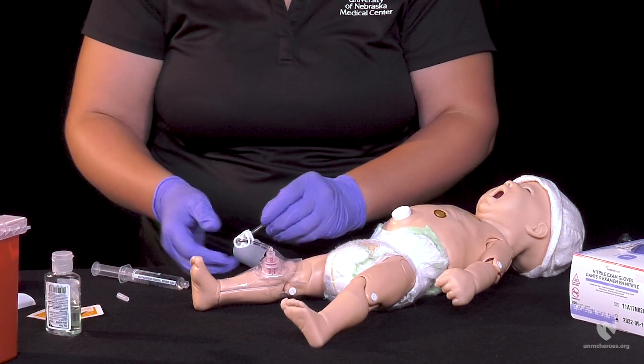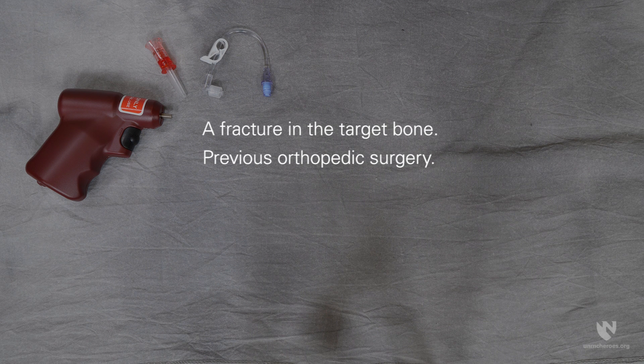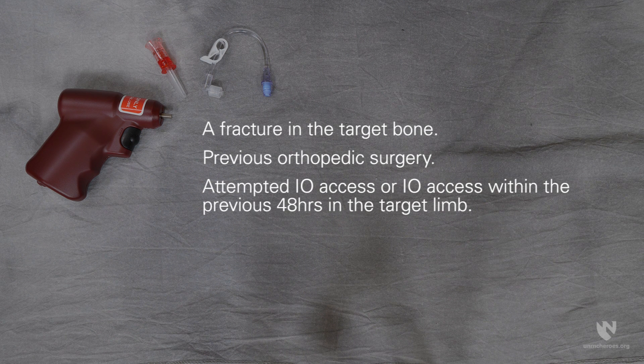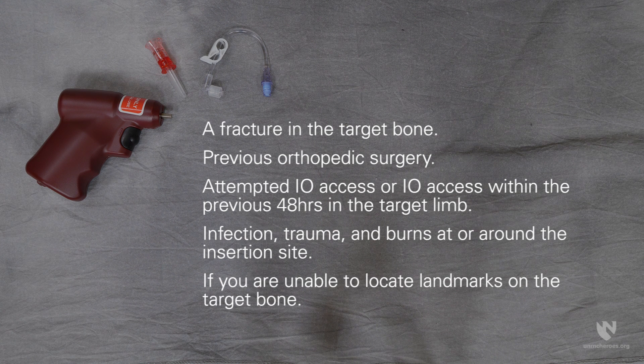Finally, be sure to secure your extension set. There are some contraindications to IO infusions. These include a fracture in the target bone, previous orthopedic surgery, attempted IO access or IO access within the previous 48 hours in the target limb, infection, trauma, and burns at or around the insertion site. Finally, if you are unable to locate landmarks on the target bone.